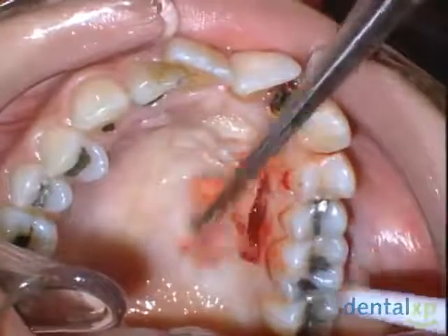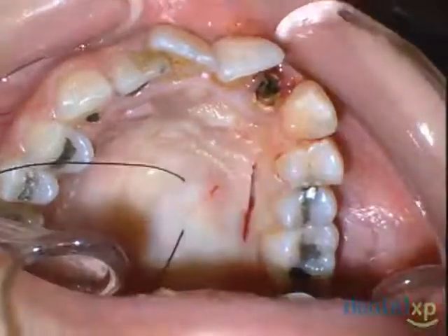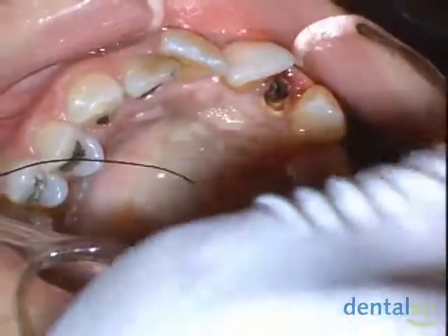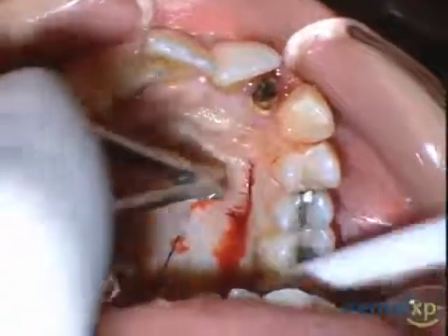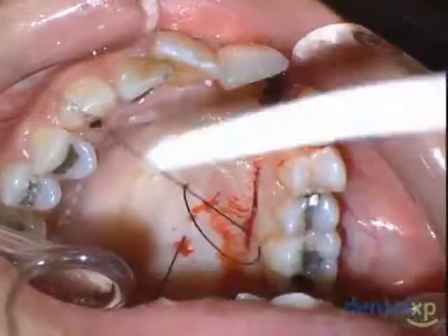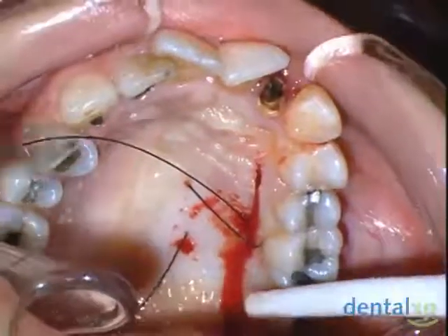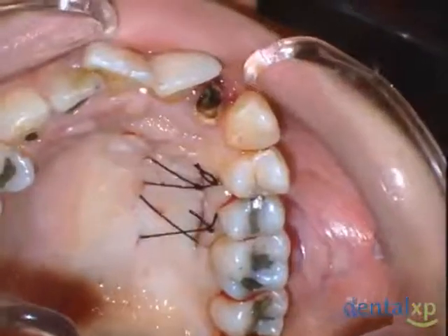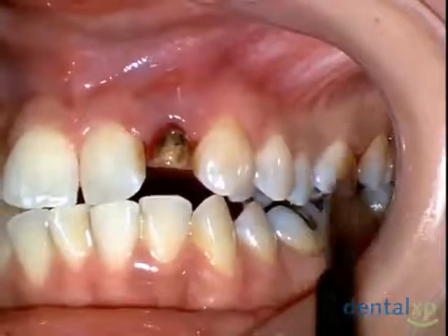And we can usually harvest this tissue very quickly and without a lot of difficulty. The process of suturing the donor site is readily taken care of utilizing horizontal crisscross mattress sutures. This suture allows us to gain hemostasis and to provide for a tension-free and usually a primary closure of the wound space.